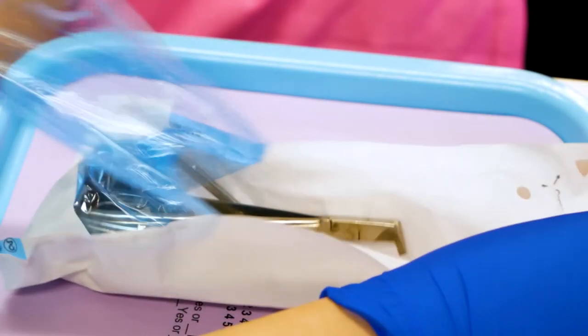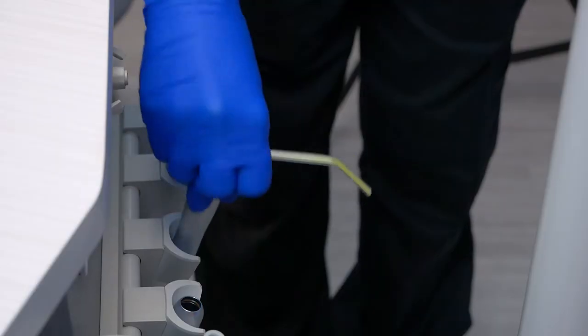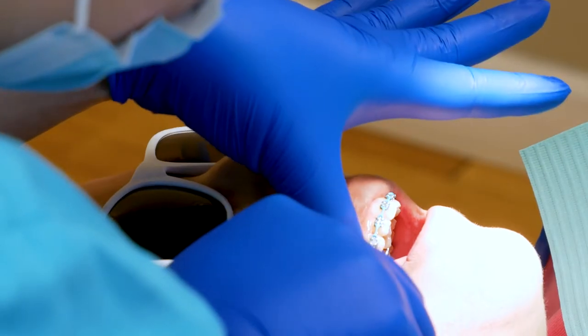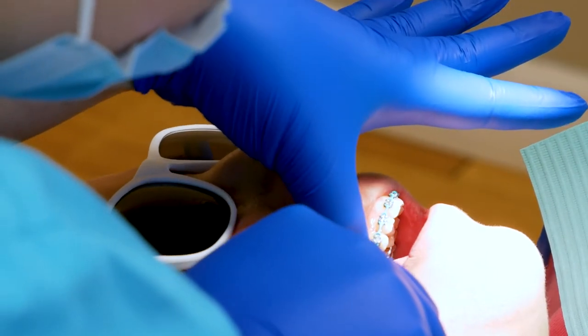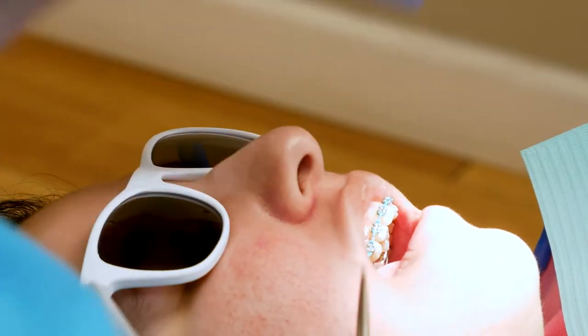There are many different tools used during orthodontic treatment. Each has its own purpose, but they all have one goal: to provide you with a perfect smile.